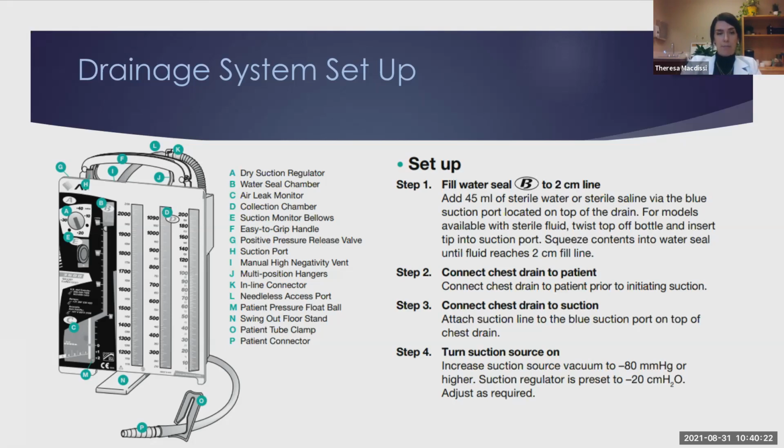We've got a patient example where a patient came in, got a chest tube placed overnight. I came in around 9 in the morning to see the patient for a consult. The patient has a thoracic tube coming out and it's directly hooked to wall suction. There was no drainage system set up on the floor. So they were set to intermittent -40 suction. That is incorrect. That is a bad idea because there's no way to know exactly how much pressure is being applied to the patient's intrapleural space. So always make sure that you set up your drainage system correctly.